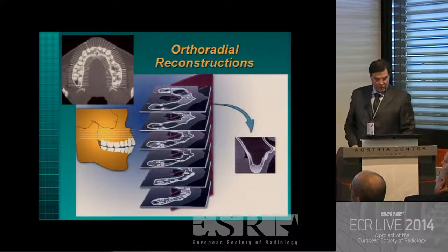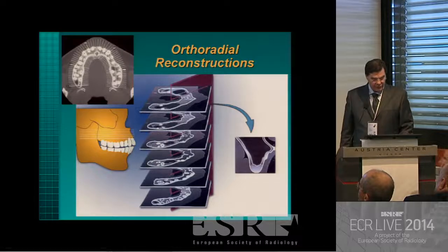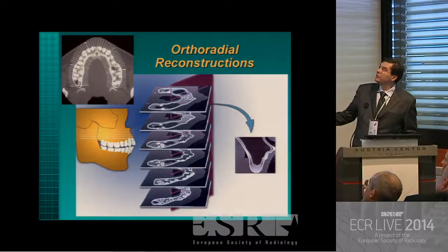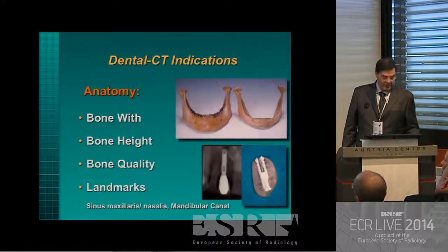Okay, so you get the images from the dental CT device. There are reconstructions performed by the devices, multiplanar reconstructions, so you get the alveolar crest visualized from the different slices. And you can then perform imaging for evaluating the implantology bed for the implant.